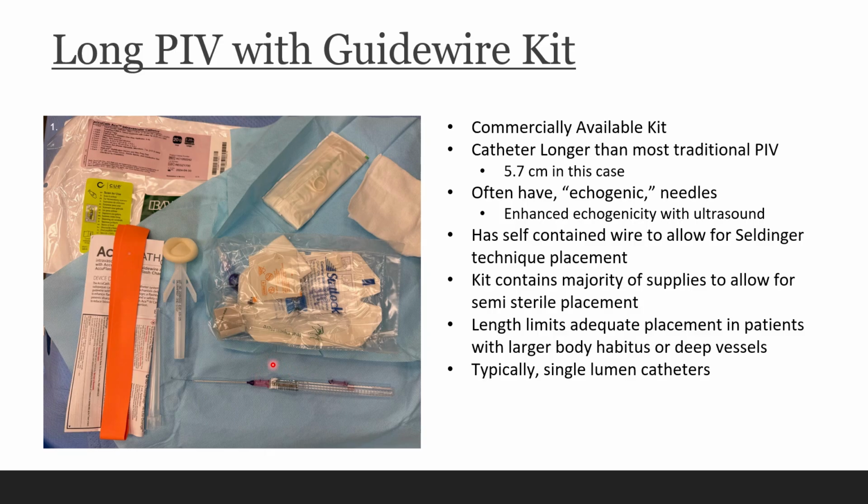This has got a neat little trick where you take everything out. It's got a self-occluding valve, but our reps don't want us going deeper than about 2 centimeters. Reason being is if we go deeper than that, we may not have enough catheter purchase to ensure that when we push things through that or the patient moves around, it doesn't get pulled out.